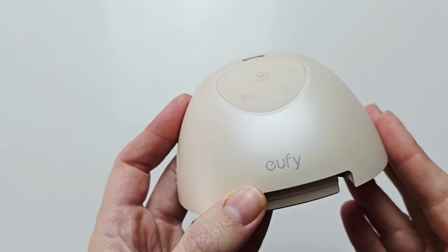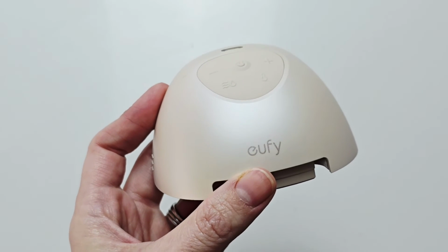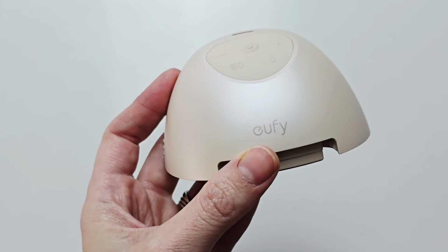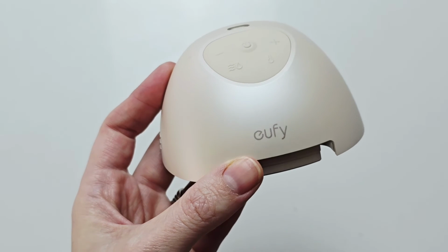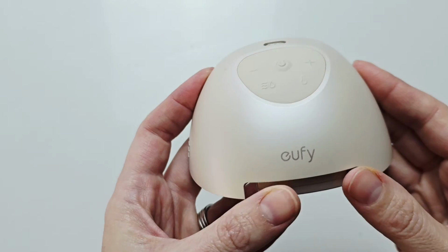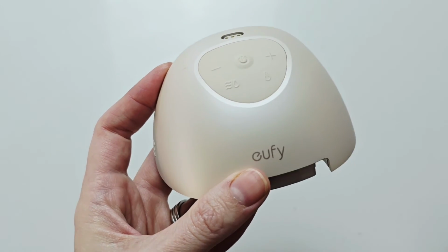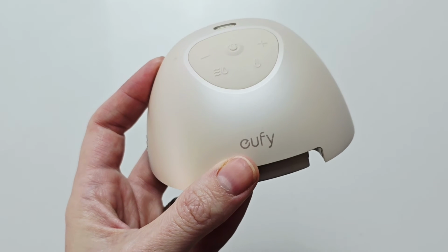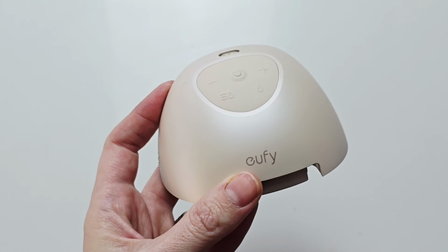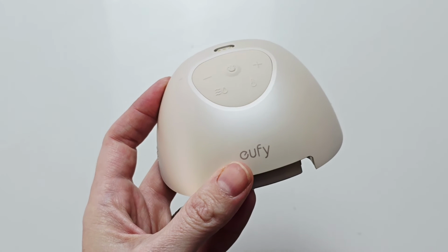Like I said, Eufy don't actually highlight how long theirs is, but you should get a really good use out of it. Again, depending how often you're using it, maybe a year, maybe two, might be a bit less if you're pumping multiple times a day with it, but it should give you a good pump motor life. However, if you have issues such as it's not charging and it's quite early in your pumping journey, or you haven't been using it very much and it suddenly dies, reach out to Eufy customer service and see if your pump is still under warranty.